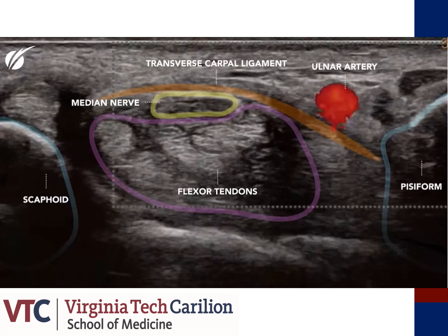Prior studies have been done which demonstrated that a hand surgeon or any physician who wishes to complete ultrasound assessments of carpal tunnels within the office, it's about a 20 patient learning curve in order for them to obtain dexterity at this exam.